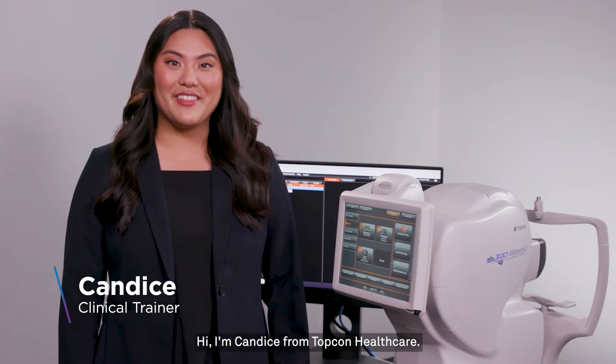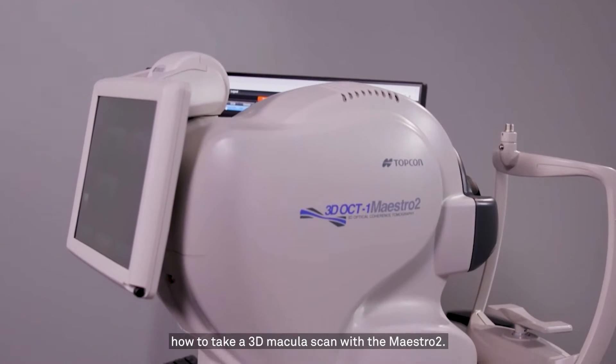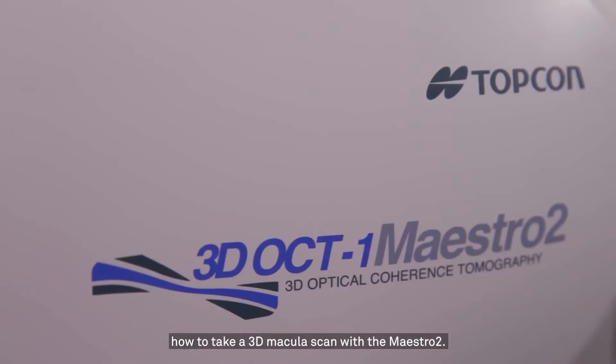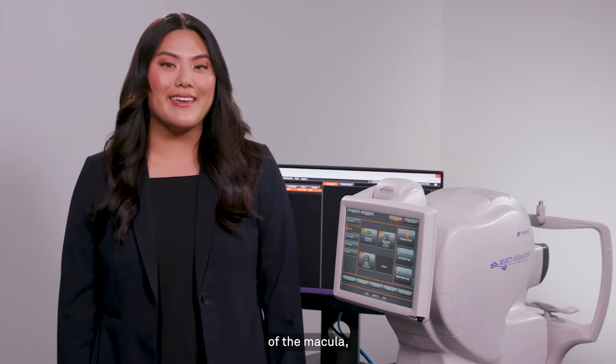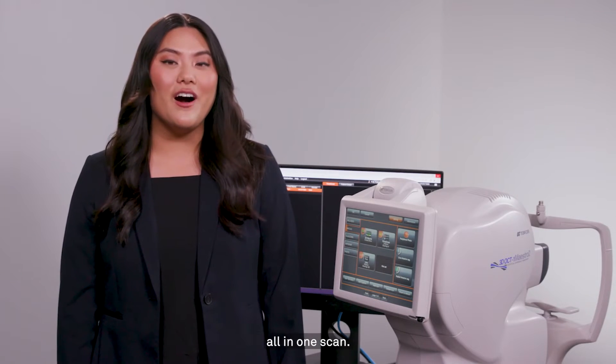Hi, I'm Candice from TopCon Healthcare. Today, I'm going to show you how to take a 3D macula scan with the Maestro 2. The 3D macula scan takes a 6 by 6 millimeter OCT scan of the macula as well as the fundus photo all in one scan.